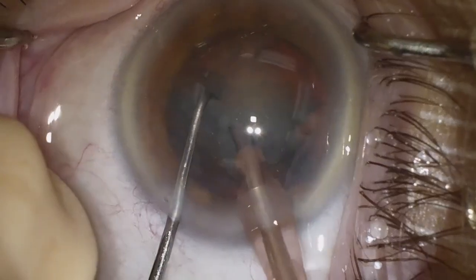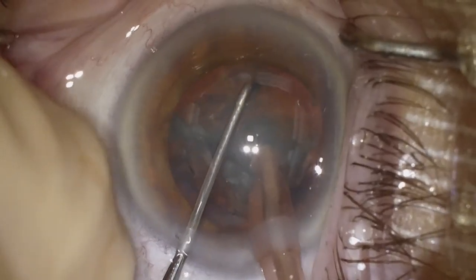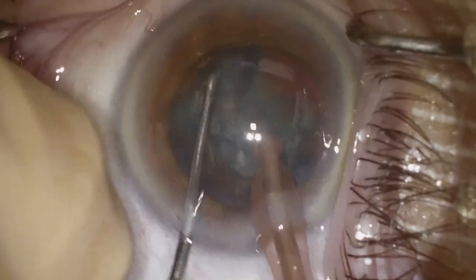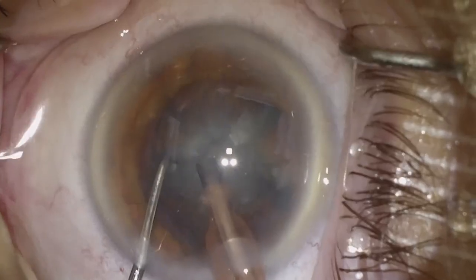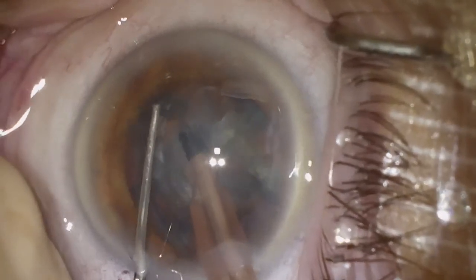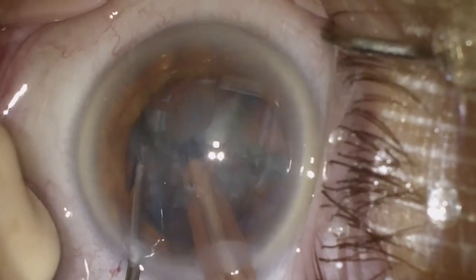So we've got a decent crack here, good rotation. We've rotated, we have one heminucleus, and we're going to split this heminucleus into two quadrants, using a Nagahara chopper to do a horizontal chop maneuver. And then we rotate, good rotation here, and then we have one heminucleus left, which we'll also attempt to crack into two. Very nice. We've got a good chop there. And now we have four quadrants.